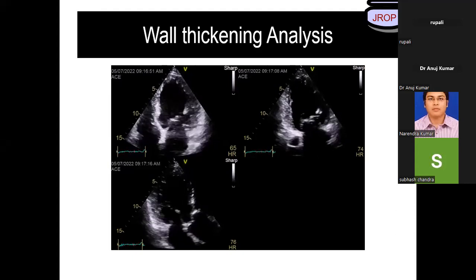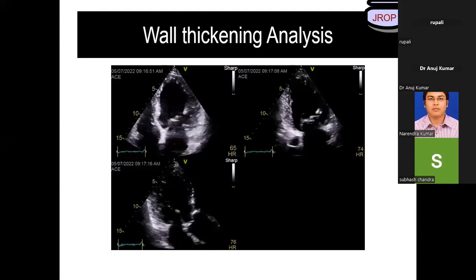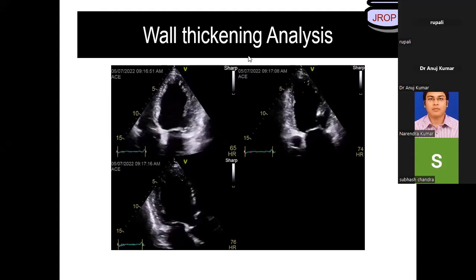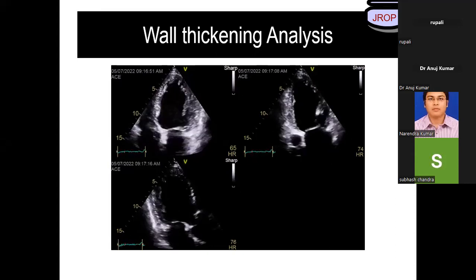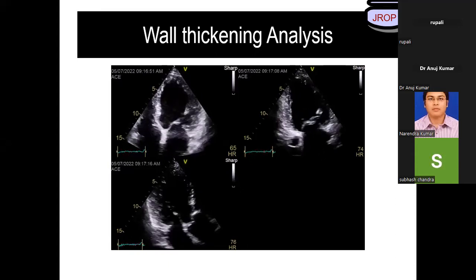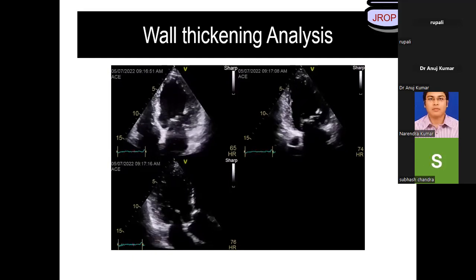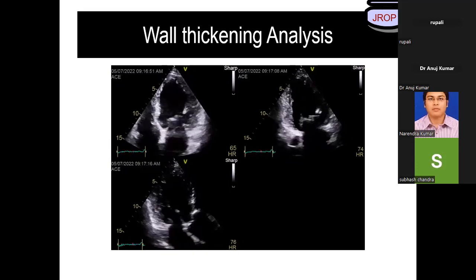All right. Only those people should raise hands who have got a correct answer, or I'll deduct your marks. So be careful when you start answering your question. You can still withdraw yourself. Whenever you're confirmed about an abnormality, then you should attempt the question. So Nitin, I'm sorry, I'm not able to agree with you. I'll move this question to Rupali. Rupali, want to take this question? Yes, sir. Go ahead.